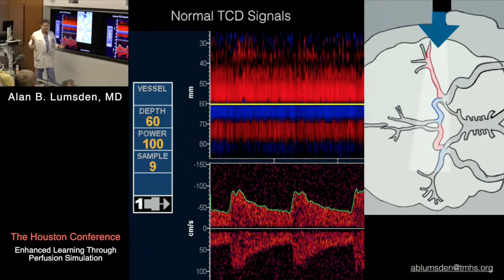We use this, every carotid intervention, every arch intervention, we're doing transcranial Doppler monitoring. And we published doing thoracic endografts because it allows you to look at what is happening in the different parts of the procedure as I am manipulating it. Real time, immediate feedback. So for example, and Joel will show you some examples of this.